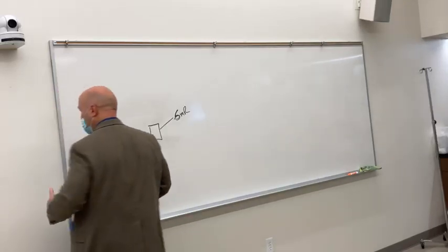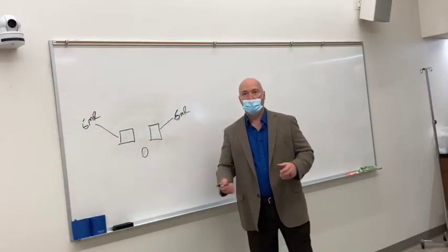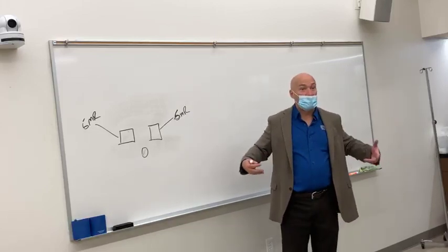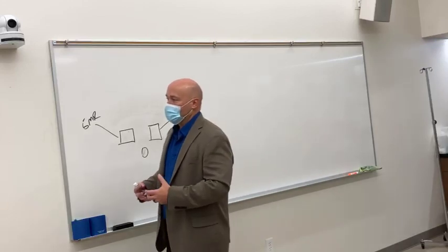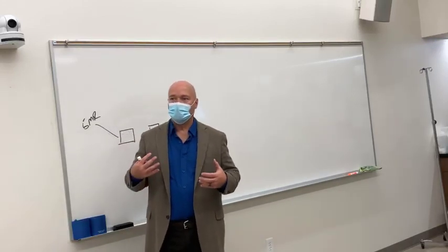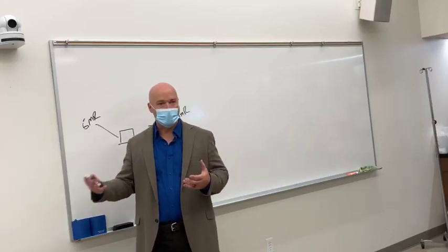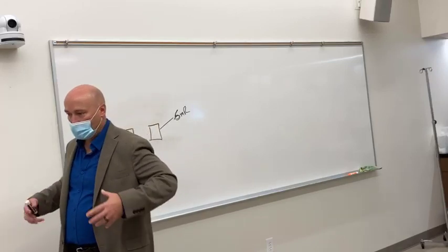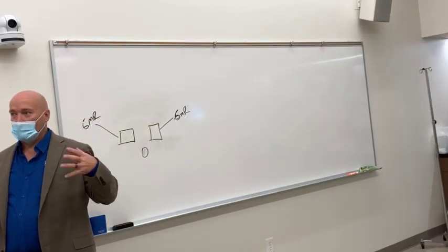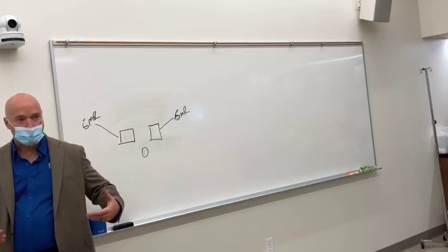So if you need an increase in exposure for whatever reason, we're going to get into spines, right? And what you'll see in spines is that different body builds are going to require an increase in exposure for certain things. Like sometimes it's hard to see through somebody who's got a thin waist and wide hips. It's hard to see the L5-S1 joint space, okay?